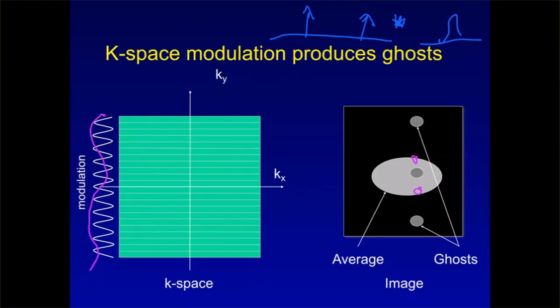Like if you did spatial temp, you could try to gate. How do you deal with this? You could potentially gate the acquisition to the heart rate. So effectively, you would acquire every phase-encode at the same phase of the heart rate, and then basically the blood will have exactly the same value, right? Because you either capture it when the blood is in, or where you basically, that's what would happen. Like you will get some new blood comes in, and so on and so forth, right?